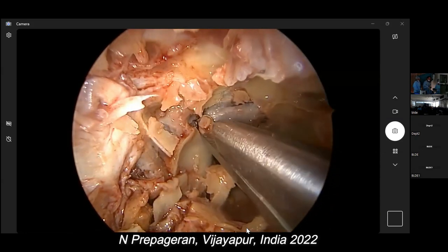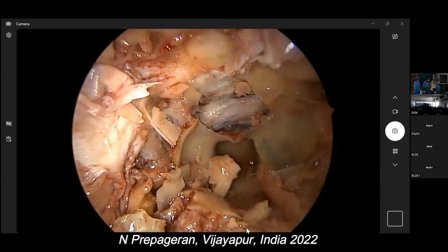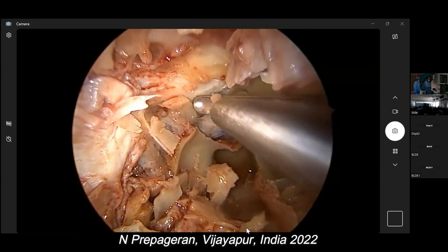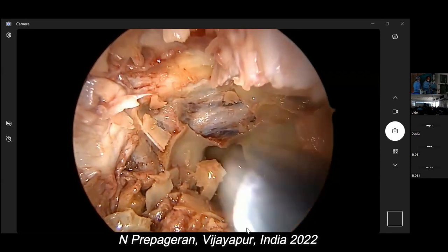Remember when you do this, put your scope away, yeah? Sometimes you cut, sometimes you flick, sometimes you just have to see which one becomes loose. That's the opticocarotid recess process.